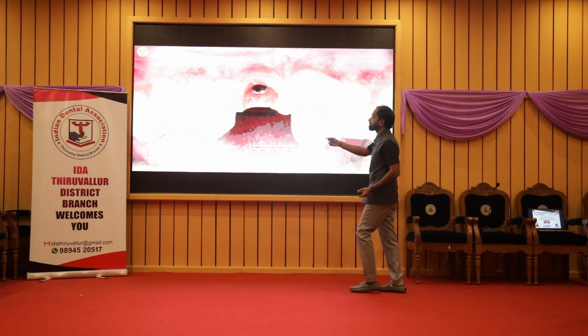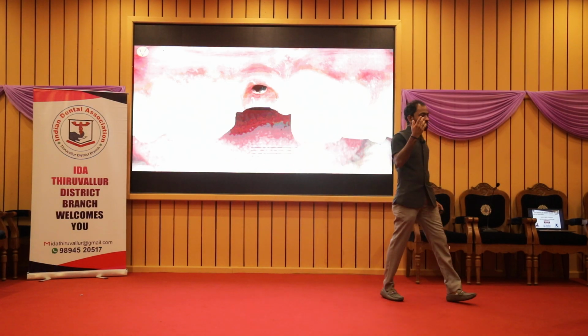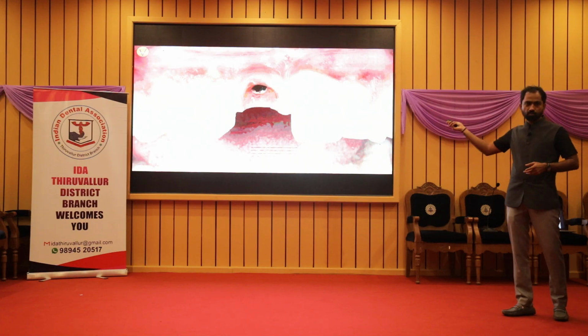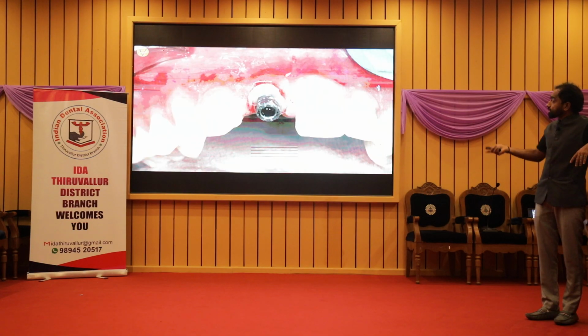Otherwise what would have happened if I had sutured it? This would have become flat. Then I would have to try recreating it. Again, it's a big headache. It might not come out how we want, because gingiva will not listen to us. We make something, maybe it will go up, it will come down. So it's a problem. So if it is possible, you can try to do that. So it's not a wound, it's a very clean emergence profile that I got.